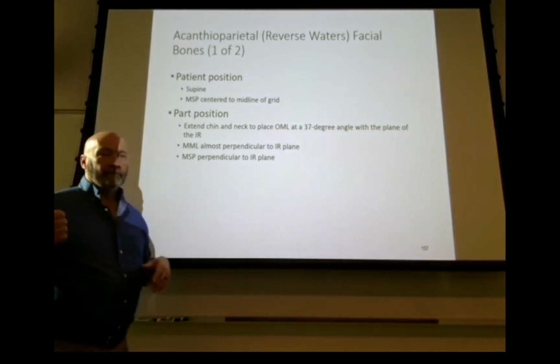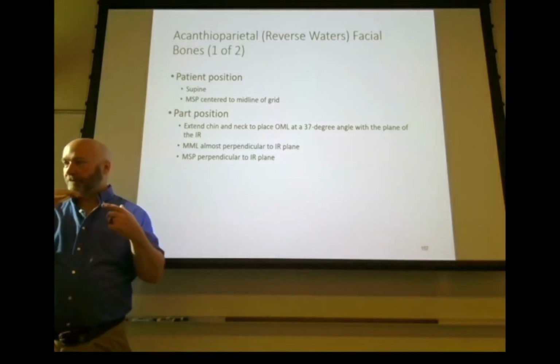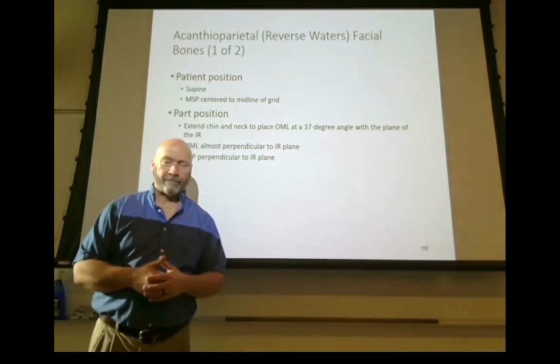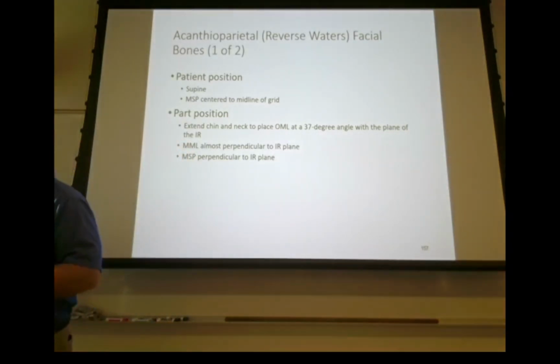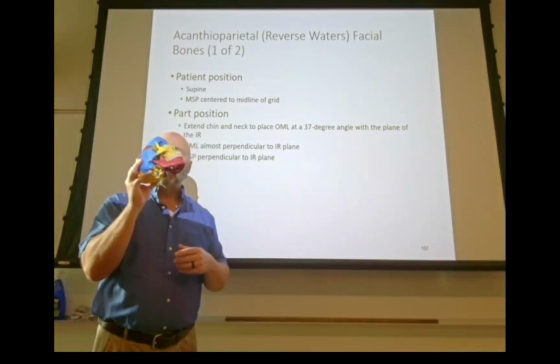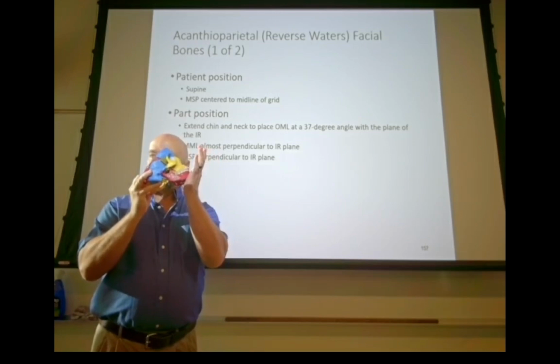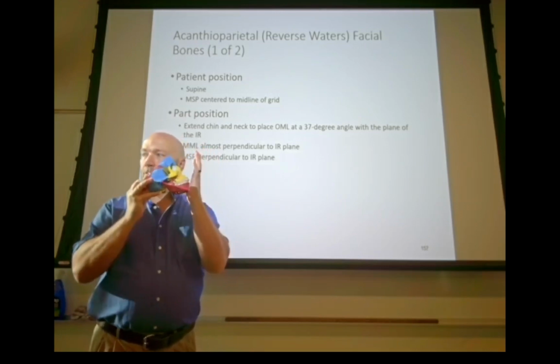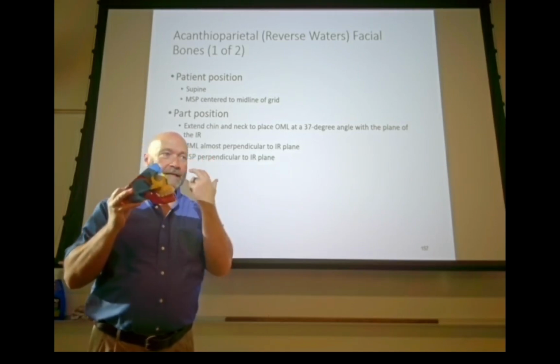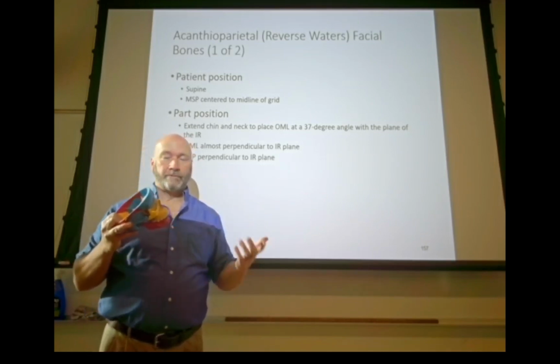So between the 37 waters showing you the maxillary sinuses and the 55 waters showing you the floor of the orbit, your chances are increased that you can make a diagnosis that the patient has a blowout fracture. Okay, so acanthomeatal line perpendicular, 55 waters, mentomeatal line, 37 waters. In sinuses, we're going to use the 37 waters. And facial bones, we're going to use both. We're going to use 55 to show us the floor of the orbit, 37 to show us the sinuses, 37 also shows us the zygomatic arches as well, tripod fracture. We can diagnose all those things.